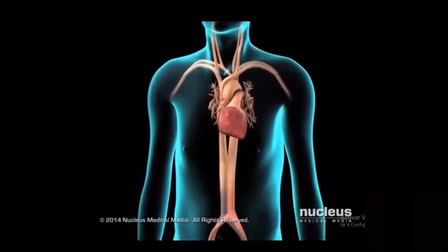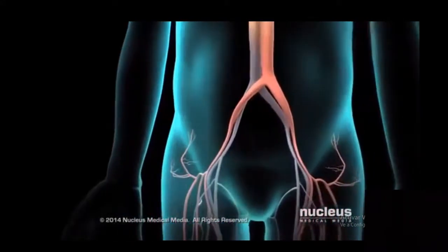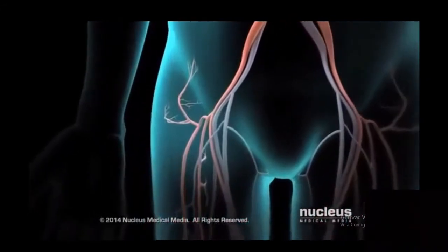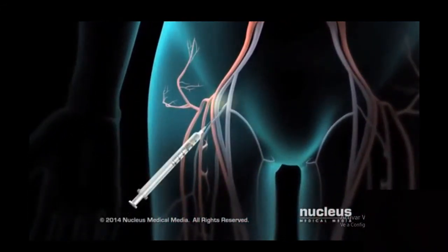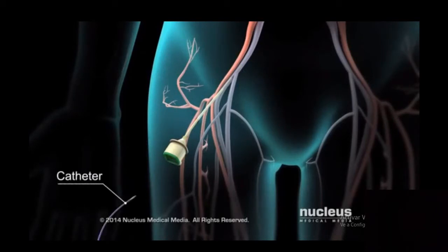For certain types of arrhythmias, a catheter ablation procedure may be necessary to stop the heart tissue from causing the arrhythmia. After numbing a small area in the groin with a needle, the doctor will insert a short hollow tube called a catheter sheath into the femoral vein. Next, a long, flexible tube called a catheter will be inserted through the sheath.